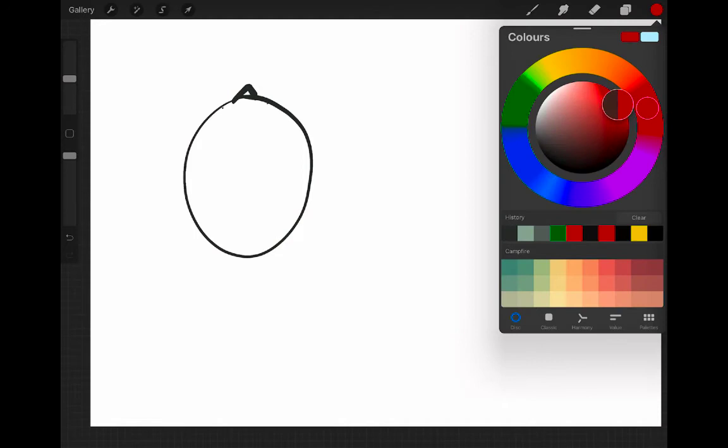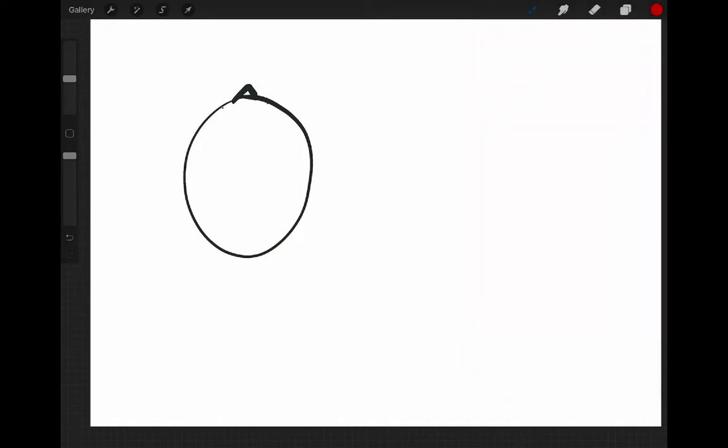All right, so what's up with this maximum intensity projection? Let me do a couple of scribbles so you understand what's going on here. Let's imagine we have a head-like object. The nose is up here, so the eyes are there. And I've just shown you that the blood vessels have this very particular shape. Maybe there's a bit here, something coming out through there. And so the question now is, how can you visualize what's going on in this 3D structure in a two-dimensional image that we want to display on the screen?